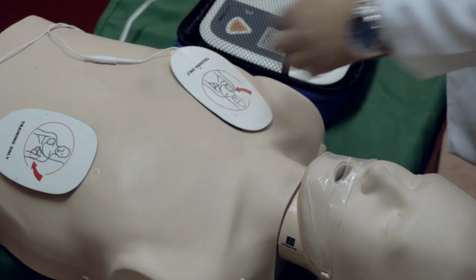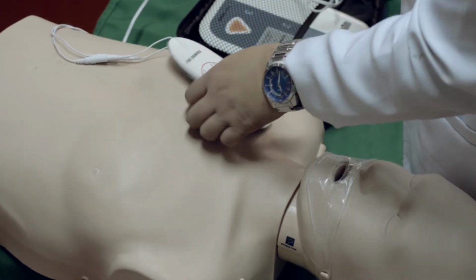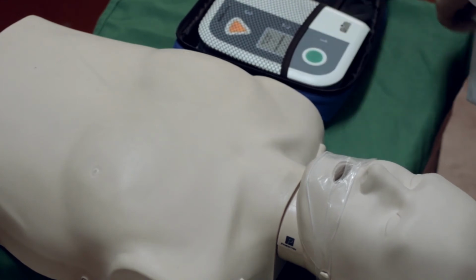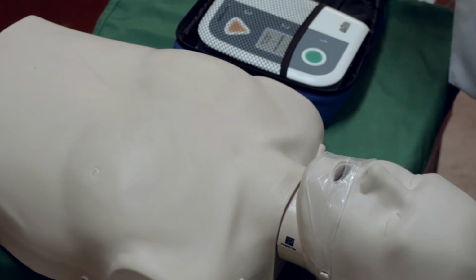The first thing that you should do before everything else is to turn on the AED. Apply pads to patient's bare chest. If you have noticed, it says apply pads to patient's bare chest.